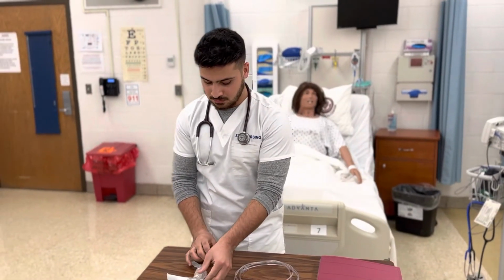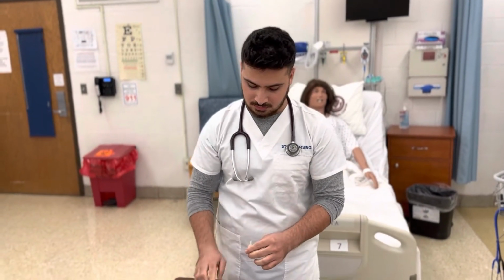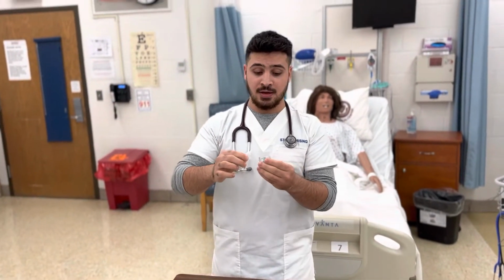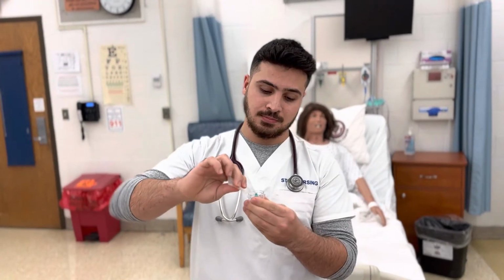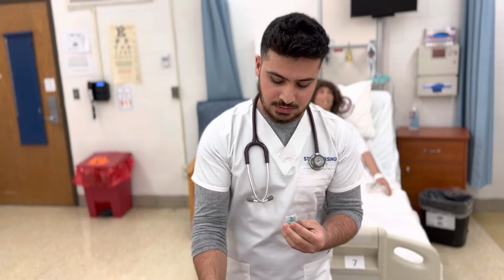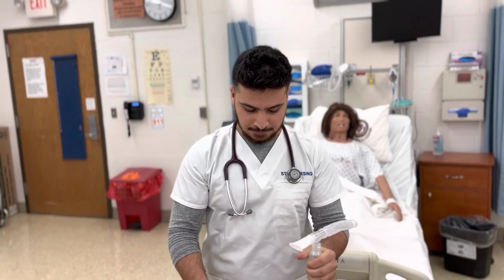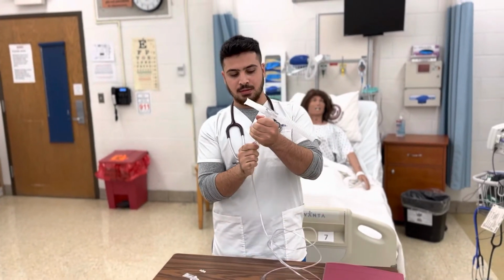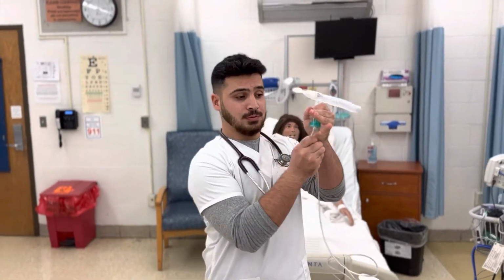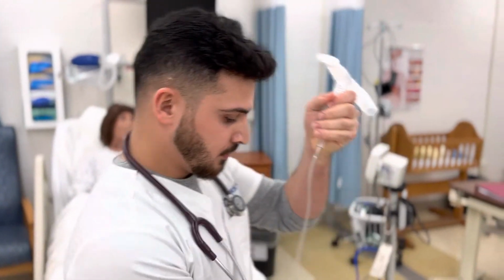We have the nebulizer device. Going to open the medication, emptying it into the nebulizer cup. Then close it. Then connect the tube. Then now go to the patient's bedside.